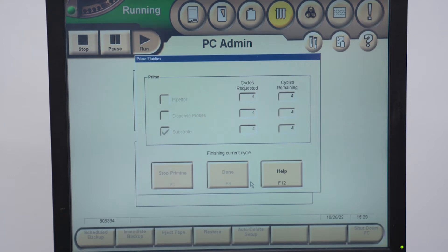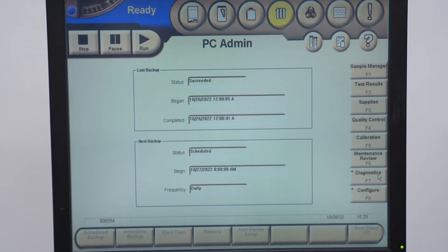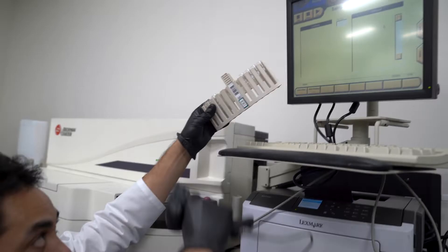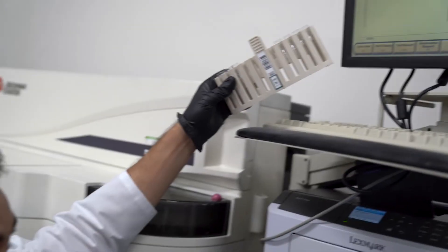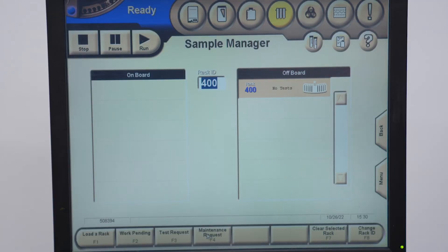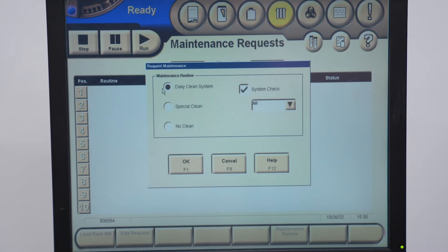Next we need to run the daily system clean. Click on Sample Manager and scan a rack — scan it in. Now go to F4 and select Maintenance Request. Click Maintenance Request, choose the daily clean, click OK, and that's good.